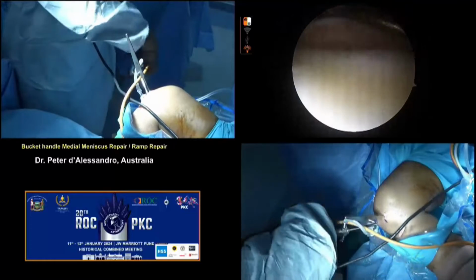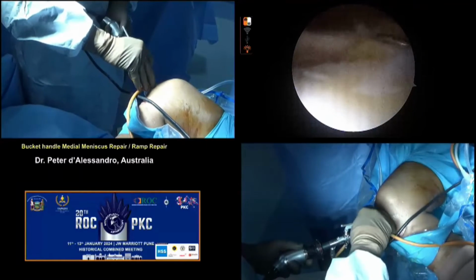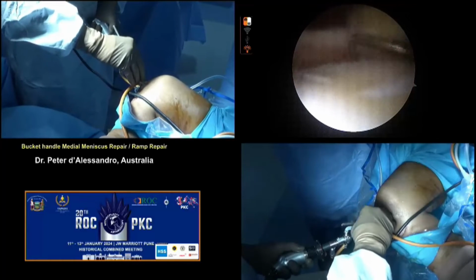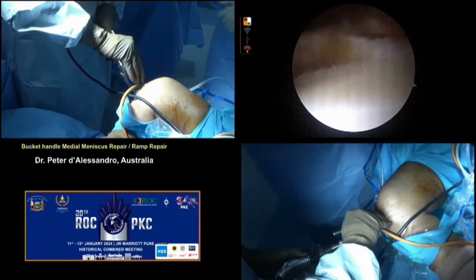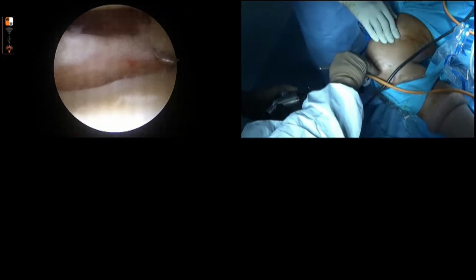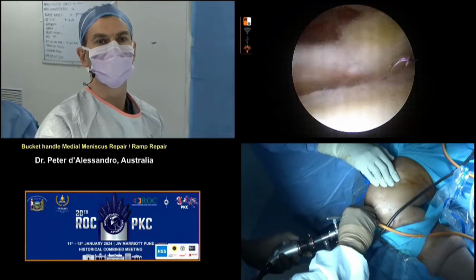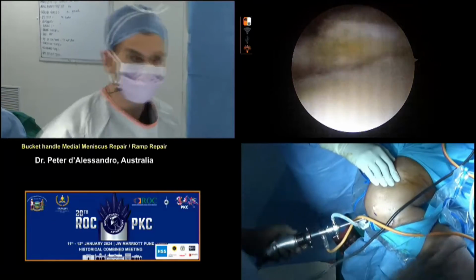And then if we have a look at our root attachment, we have this Risberg variant, or as Aaron described, a type 3, which is pretty much complete. And the majority of the root is attached to this here. So we are going to aim for a side-to-side component to that. So it'll be a combination of vertical mattress and side-to-side. If we're in trouble, we're happy to switch to a slightly non-anatomic root repair using this component there, but we'll deal with that in a little while.